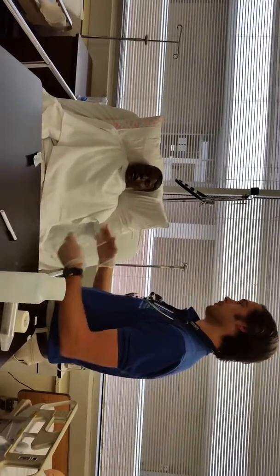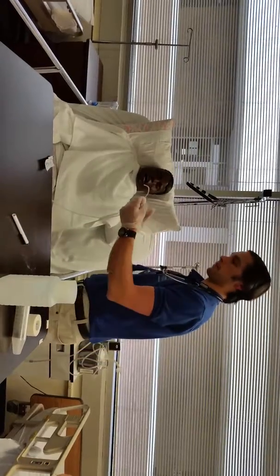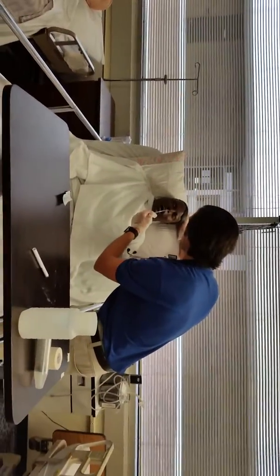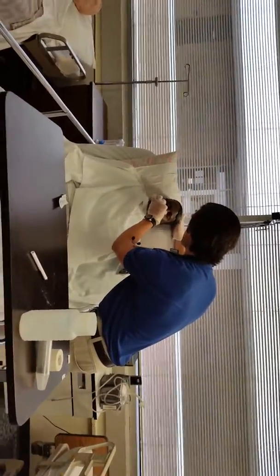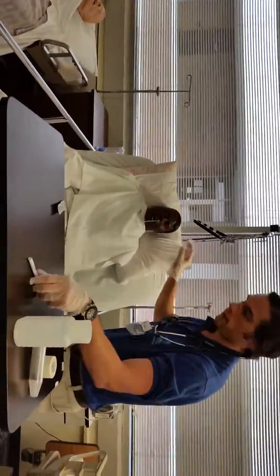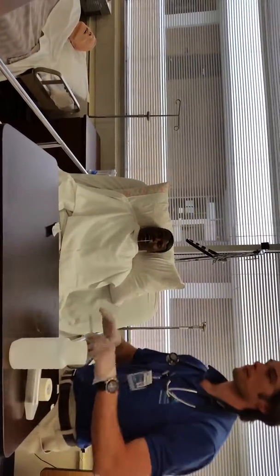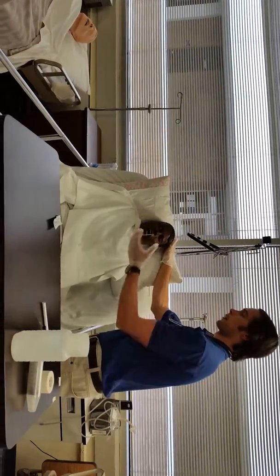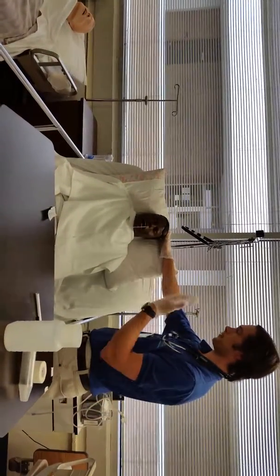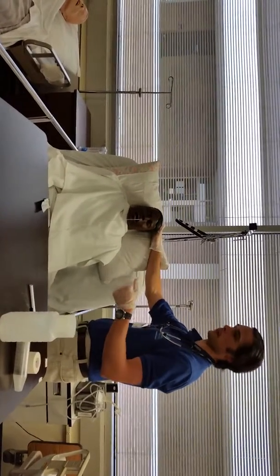Then I would have the patient tilt their head back and begin to insert it. So the left naris, go in to the 4 inches, check and see the back of the throat. No coiling. If the patient were to gag or cough more than normal, I would stop, let the patient rest, and then advance.